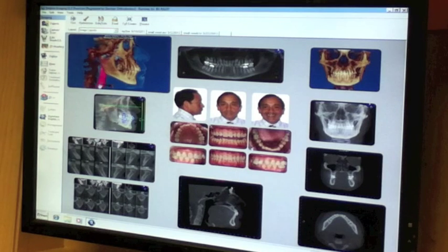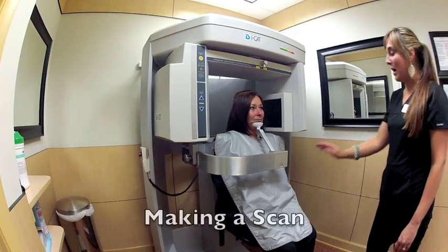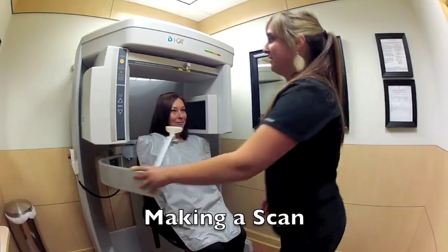Now I'm going to teach you how to create the template that we use in our office for all of our new patients and their final records. Okay, scan's all finished. That was great.